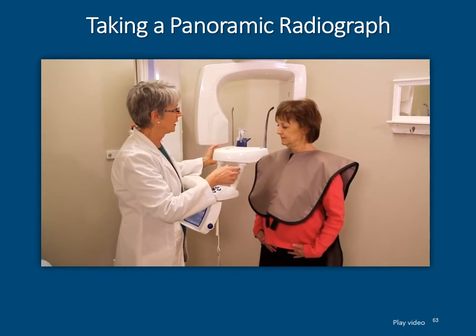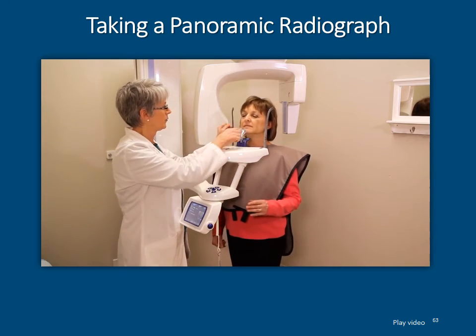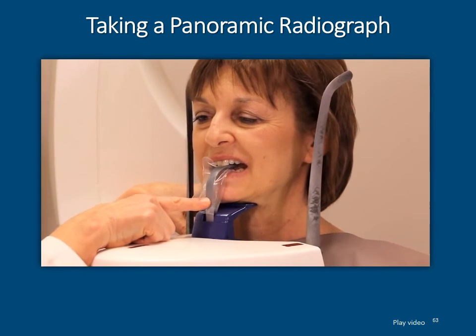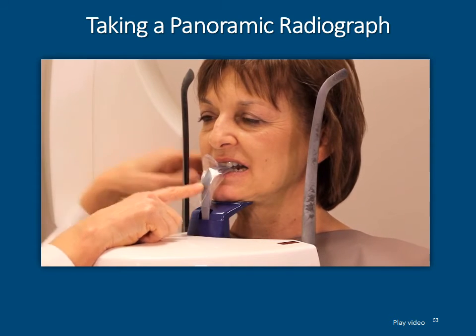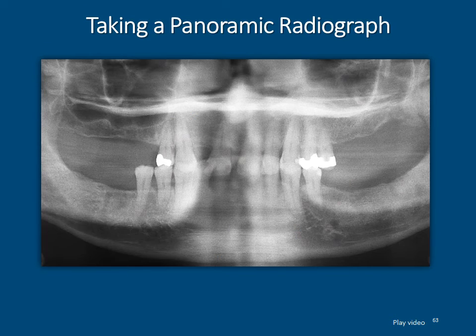We want to bring the patient in. You want to make sure that the patient is biting on this bite block. If she's not biting on this bite stick, what will happen is the teeth will be overlapped, and I do have an image of that to show you now.